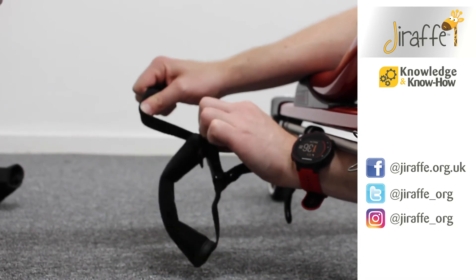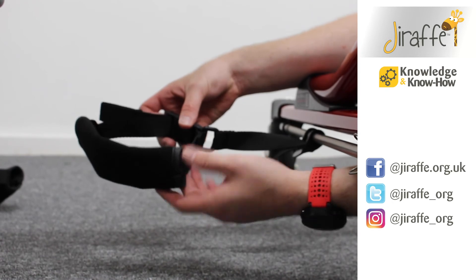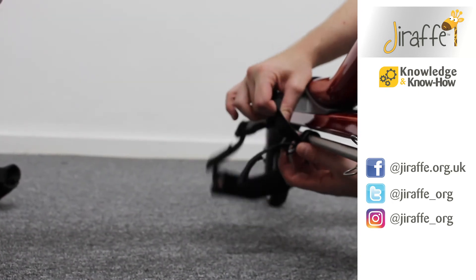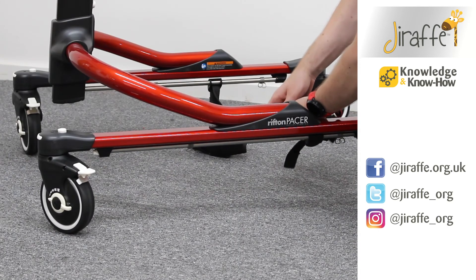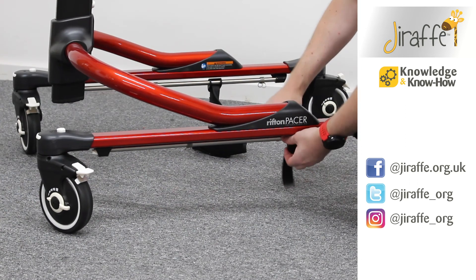We're also able to adjust the length of the ankle prompt itself. The ankle prompt will go around the user's ankle — we can adjust the tension and we can adjust the length.